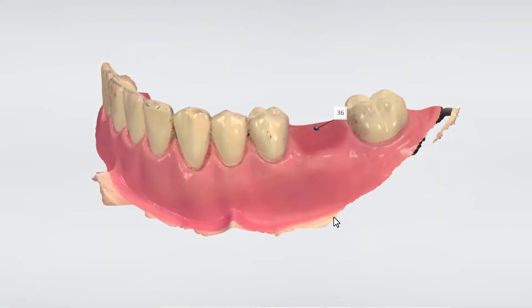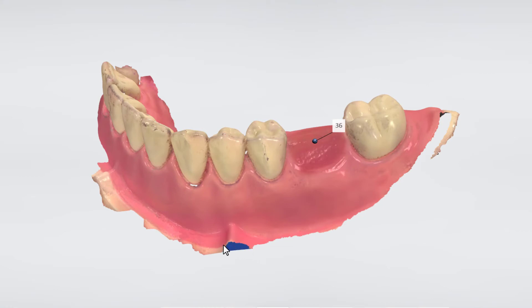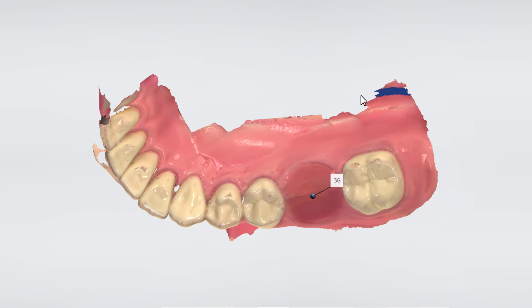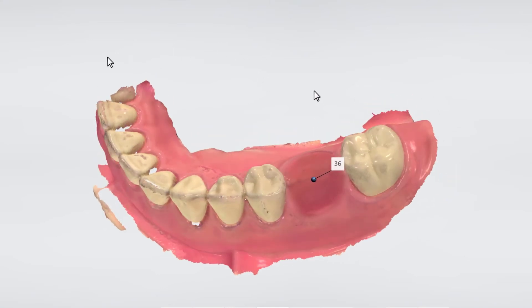When we now look at the digital model we can see that we have about 15 millimeters of surface that we can place the guide on. Remember to scan the quadrant so you have the freedom to rest your guide on as many teeth as possible to get the desired stability.